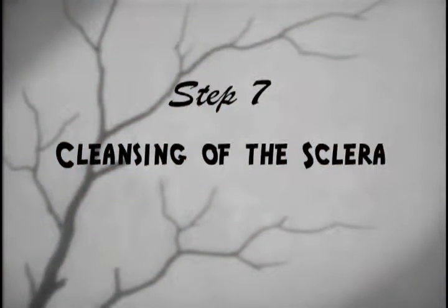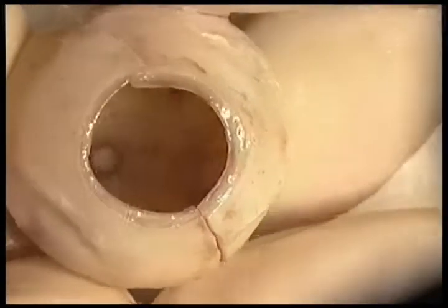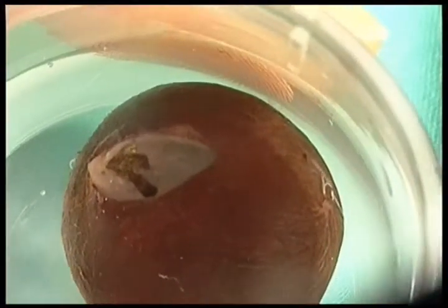We proceed to the cleansing of the muscle insertions and the conjunctiva remnants, Tenon and lamina fusca, with the help of a moist gauze. This is the final image of the sclera. After being embedded in gentamicin for 20 minutes, it is conserved in glycerin.